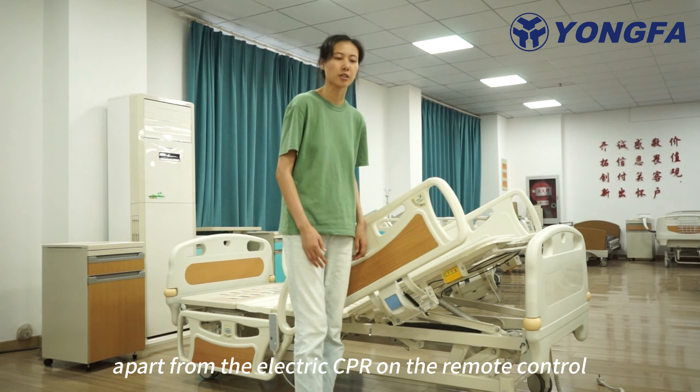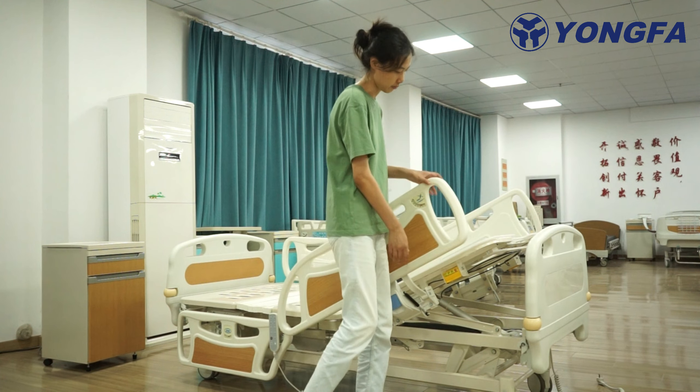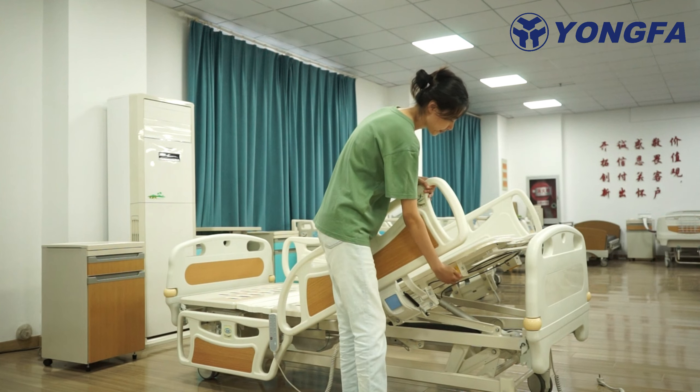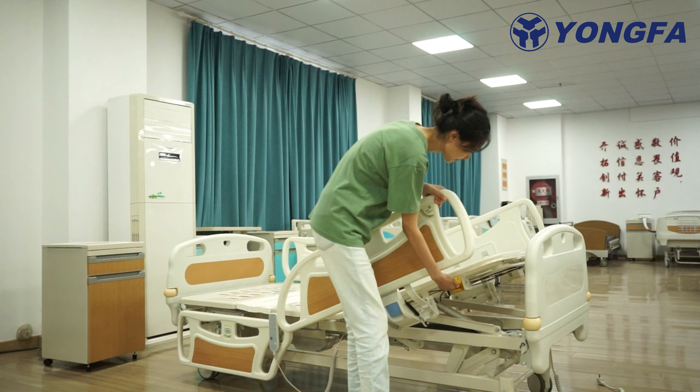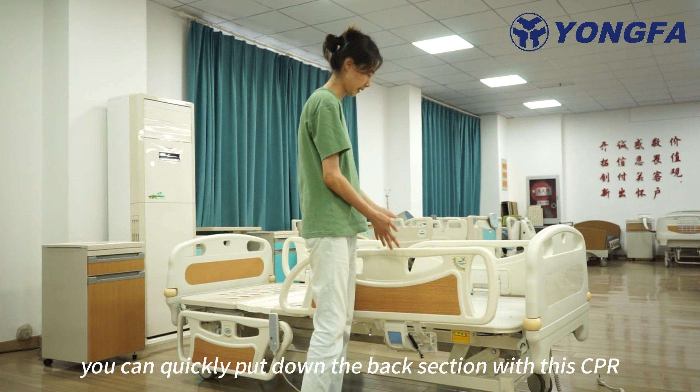Apart from the electric CPR on the remote control, we also have a manual CPR over here. You can quickly put down the back section with this CPR.